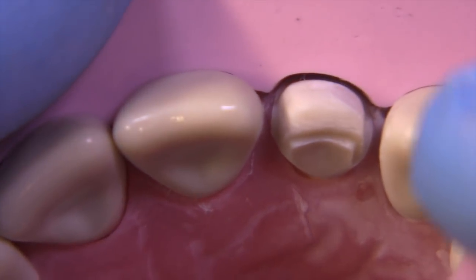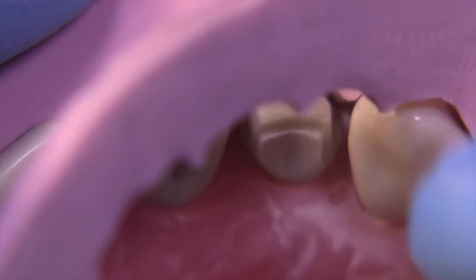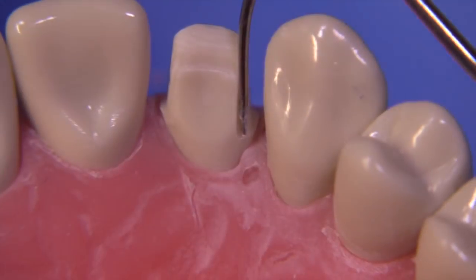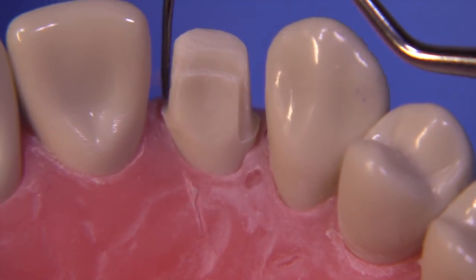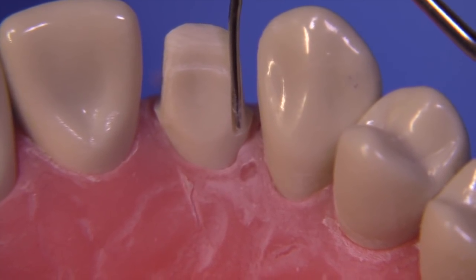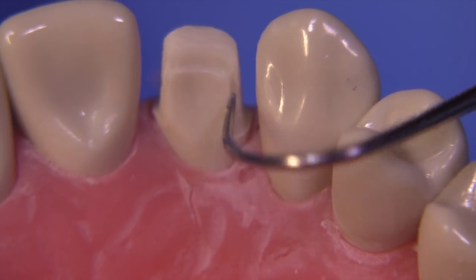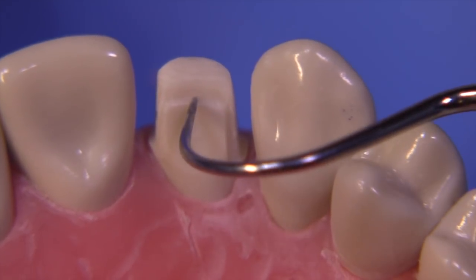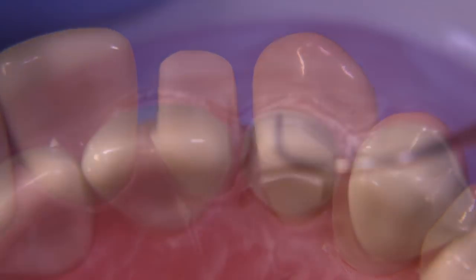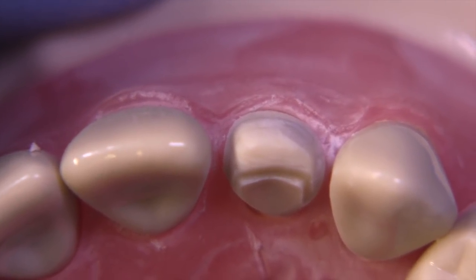After making some corrections, we can recheck the reduction and see that we've accomplished an adequate amount of clearance — it just needs a little bit more reduction on that distal area. I want to draw your attention to this distal shelf that I've created on the vertical wall — it's there so that I can grab onto more tooth structure. I placed it on the distal because the composite on the mesial side would presumably be undermining the tooth structure if I tried to wrap it around there, though you could do that as well.